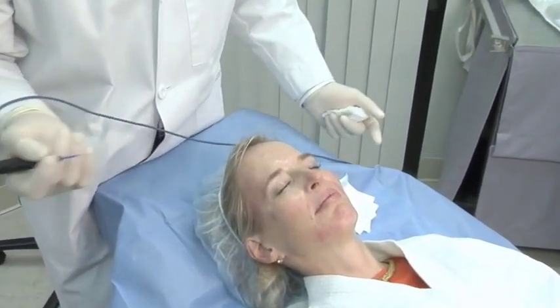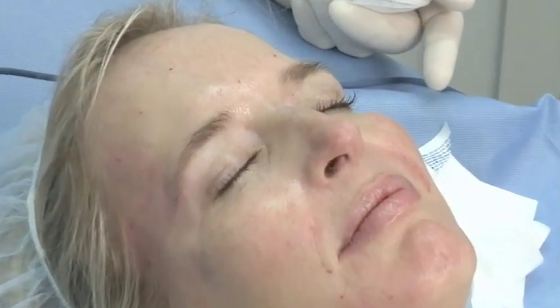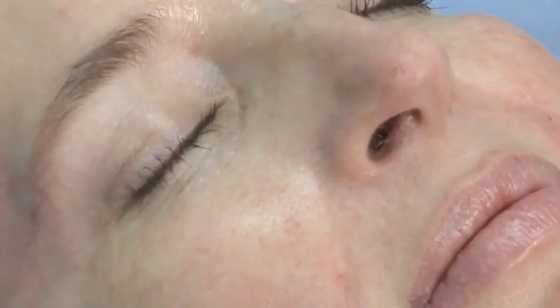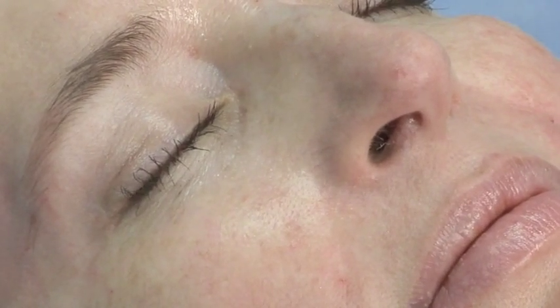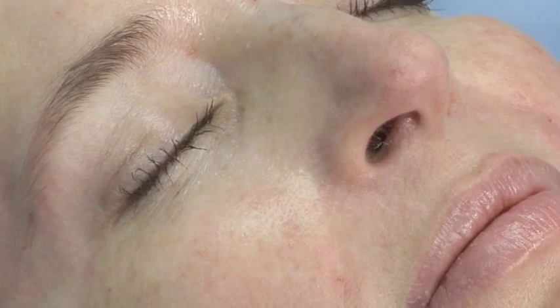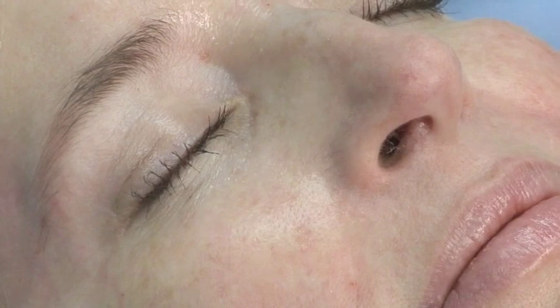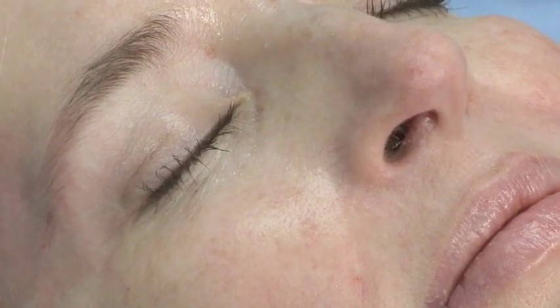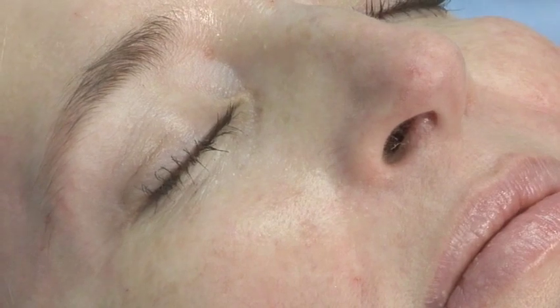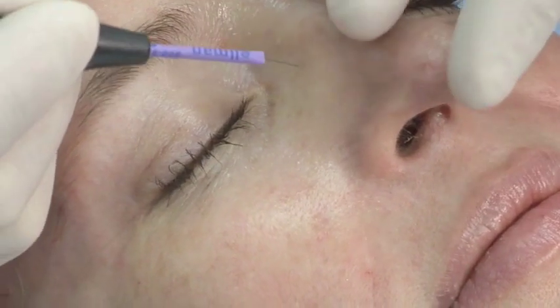I think it's very effective as well. The settings on the Elman AccuSect are using the monopolar current, and I set that a little bit higher in terms of the current — at about a level of two to three. On the dual, I set it on five on the monopolar current. That's a combination cut and coag. I've been using this technology for at least 19 years, and I think it's a nice self-contained unit and very successful.